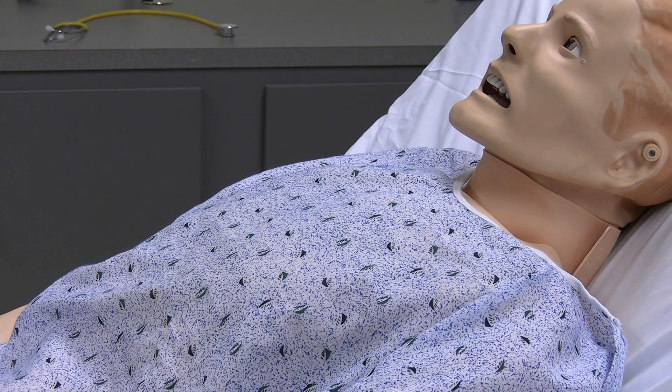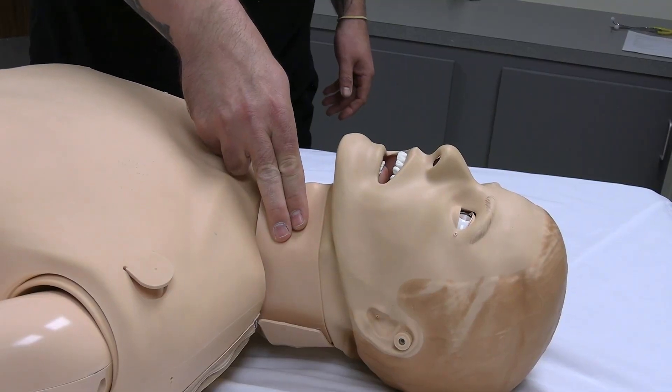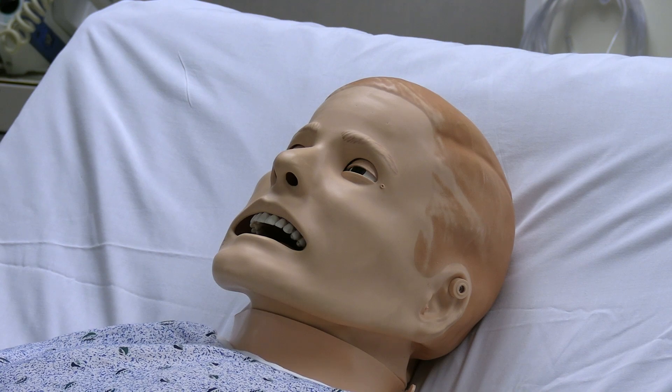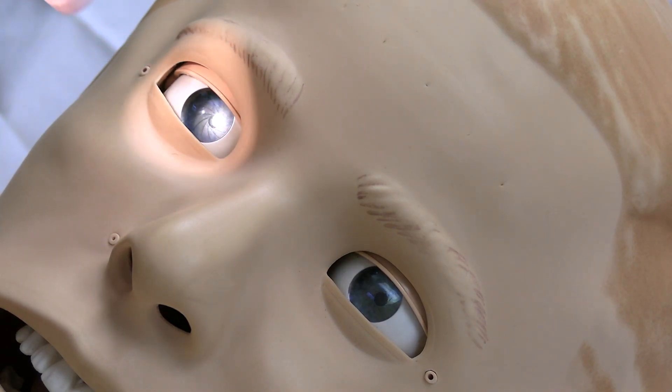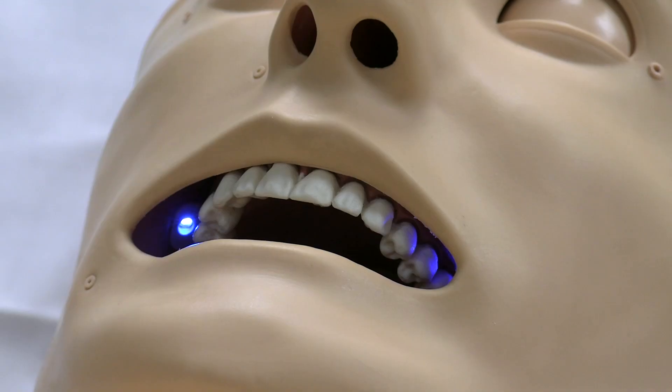SimMan 3G breathes displaying chest rise, has pulses, and even blinks opening and closing its eyelids. Its pupils also dilate, constrict, and react to light. As the oxygen saturation levels drop, cyanosis will display with a blue light in the mouth.